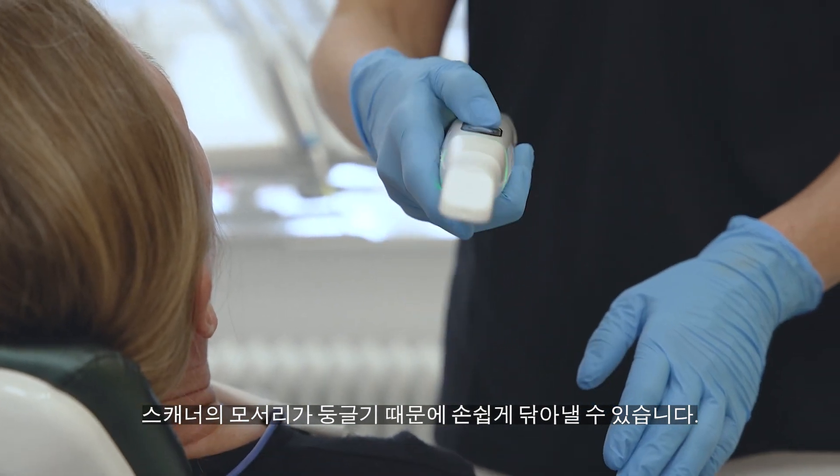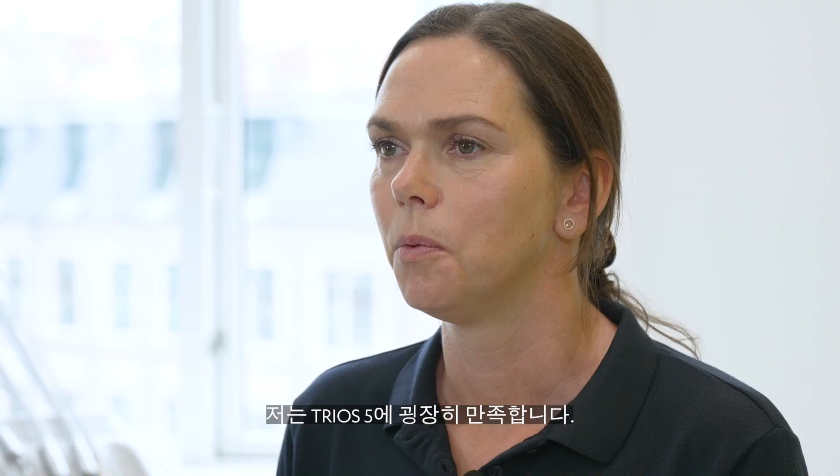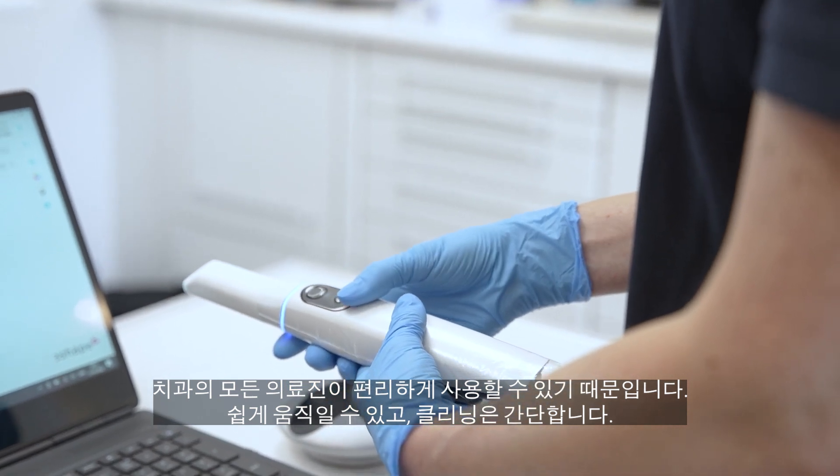I think it's genius with the scanner as a pointer, because then we don't have to go to the screen and touch the screen. I just love my Trios 5 because it's really so easy to use and we can all use it in the clinic.